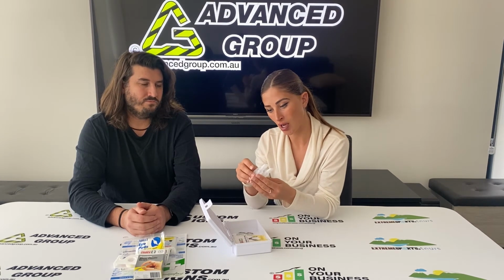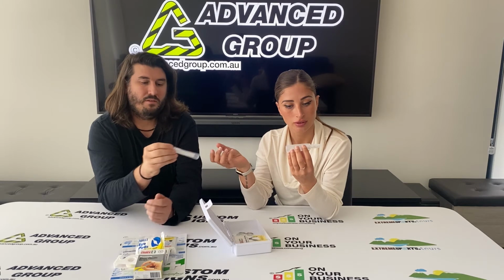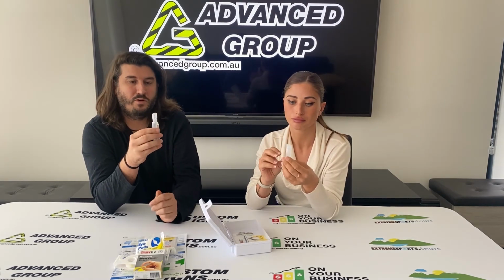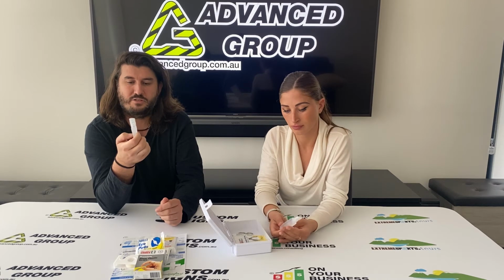We've got 2 eye wash. What are they? Sodium chloride? Yep, so it's just a saline solution. Single use, they've got a little crack seal on them to be able to open them. The point of having them like this is it's like a crash pack, or whatever you would want to call it. Once you crack the lid, it's not resealable.